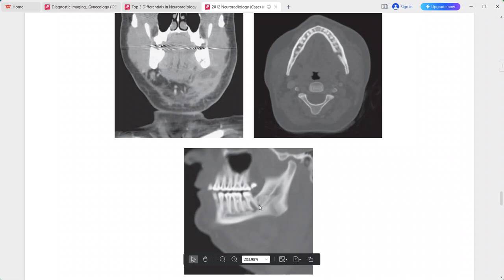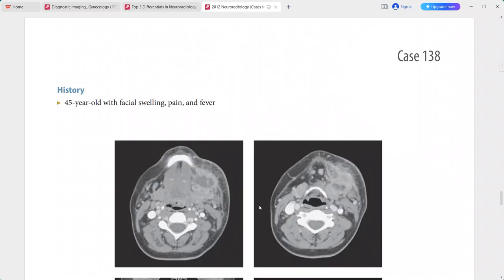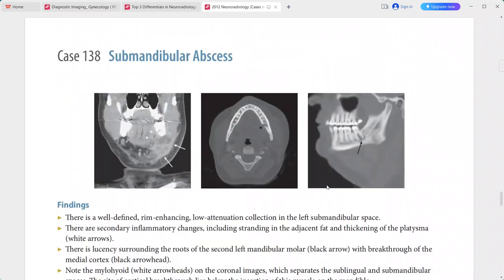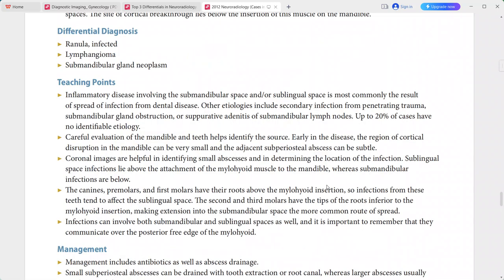This is a case of submandibular abscess. Differentials include infected ranula, lymphangioma, and submandibular gland pathology.